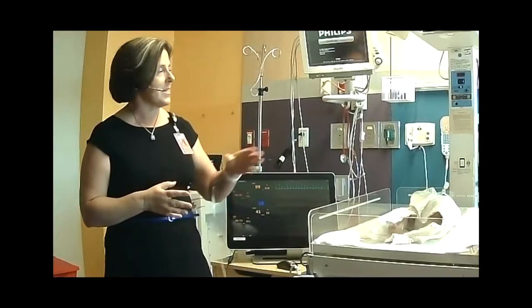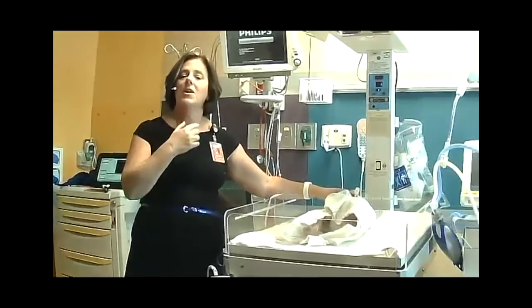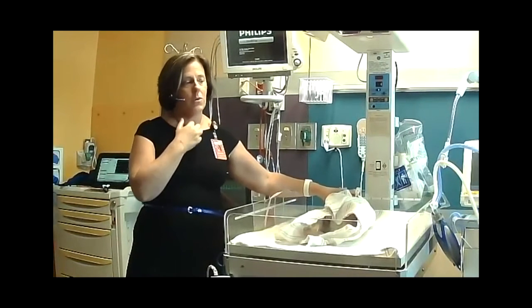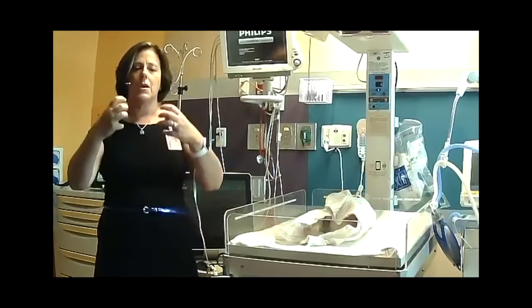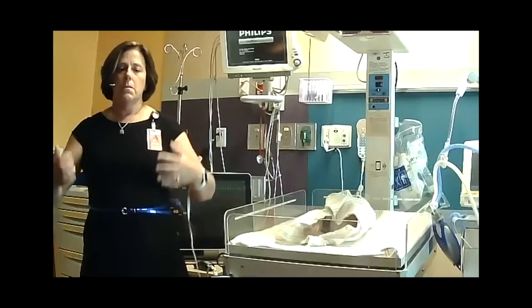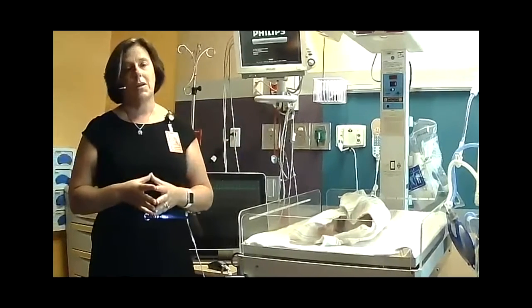If the high flow isn't enough, they say, no, I need more. We might move to something we call RAM cannula. Now what it does is actually attach to the ventilator machine, but we don't have to place the tube in their throat, which is something that makes you choke. I don't know if you guys have some problems at the dentist. I do sometimes when they're in my mouth. You think this is in the back of their throat. So sometimes it can make them cough and make you uncomfortable. So what RAM does is actually give little breaths, and it says, breathe with me, slow down, breathe with me, I'm giving you extra air, versus breathe in 80 times, go 60, 40, breathe with me like a metronome. And so we'll utilize that to not put the breathing tube in.